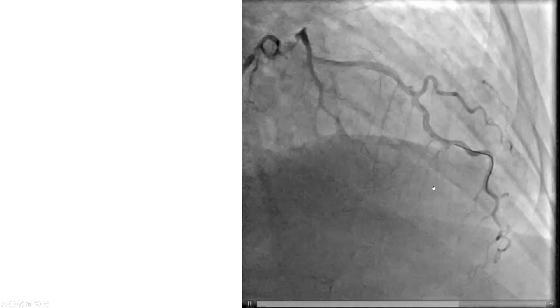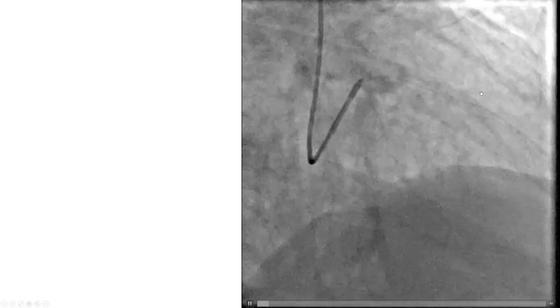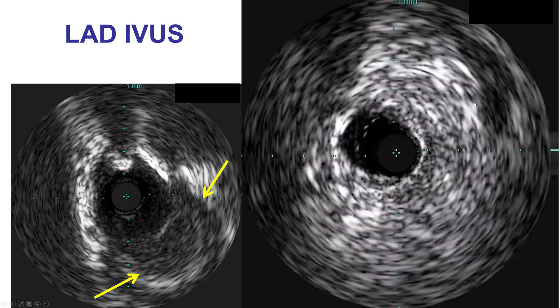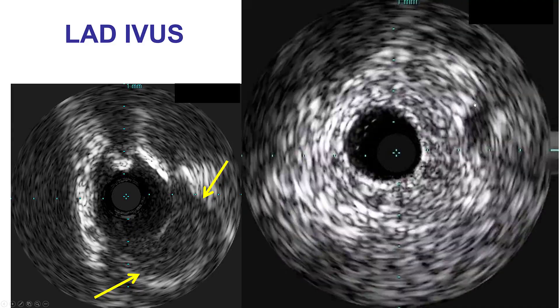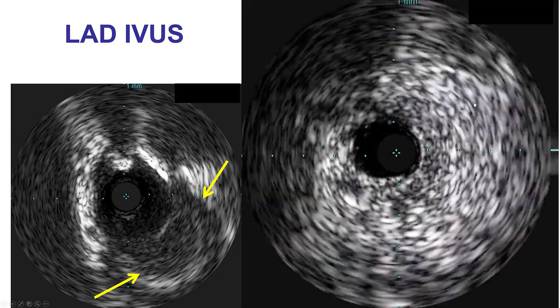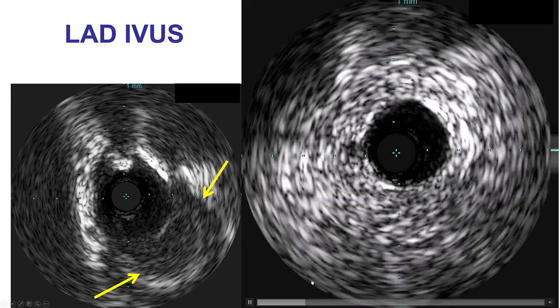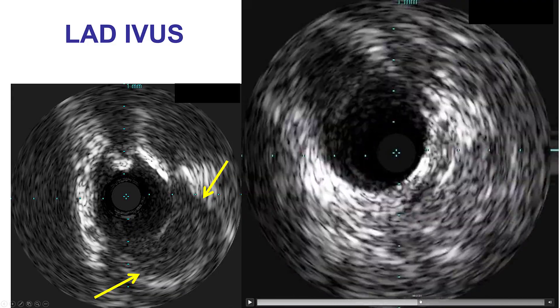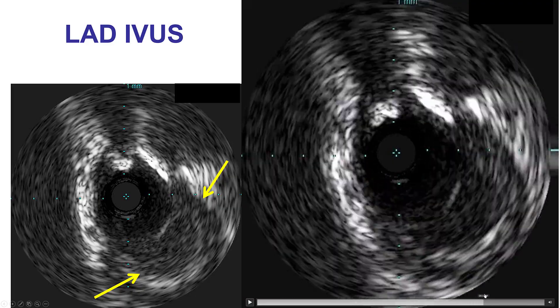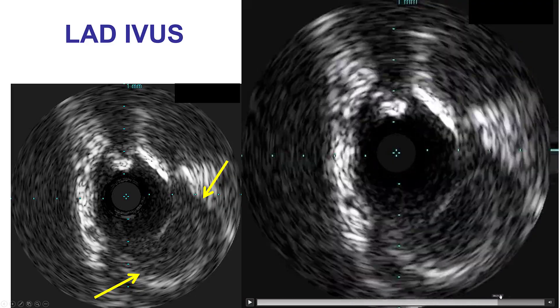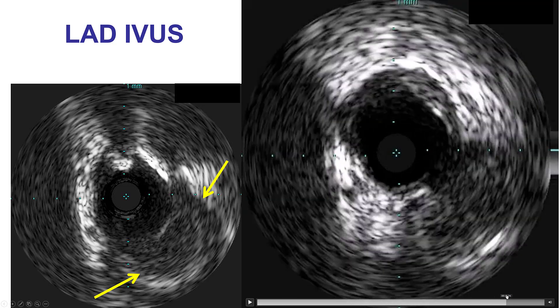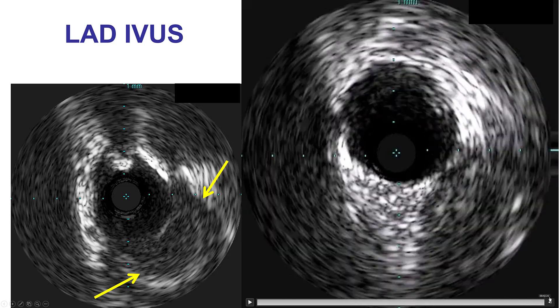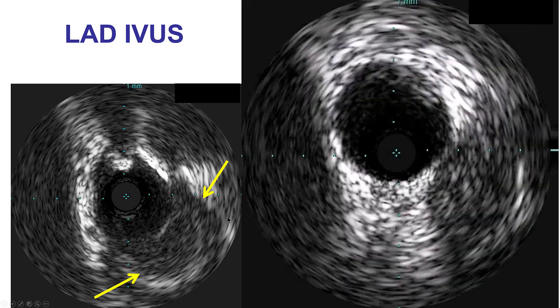The question is what to do next. How can we get to this vessel? Is this a diagonal? Is this an obtuse marginal? What we decided to do is intravascular ultrasound. We started from the LAD and then doing a pullback on the LAD. When we come to the more proximal vessel, there appears to be a large occluded vessel.